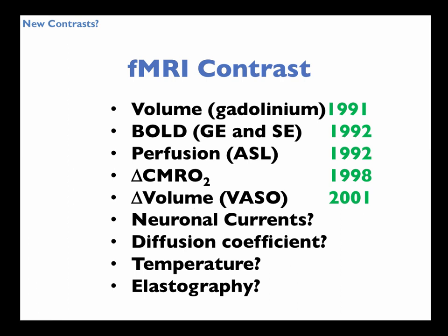If you do an inversion pulse, all the magnetization is negative, and then it goes through a null point. And it has different relaxation rates. Blood has a different relaxation rate than tissue. If the blood goes through the null point, there's some signal with the tissue. And then they image again. And so everything is dark where there's blood. The idea is that if there's more blood, more is dark. So that's very sensitive to blood volume changes.